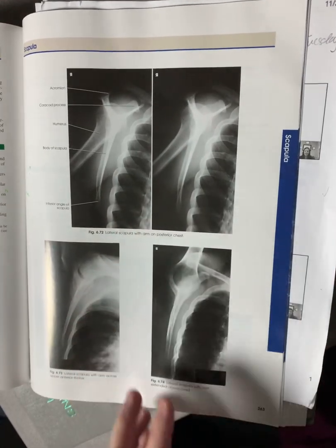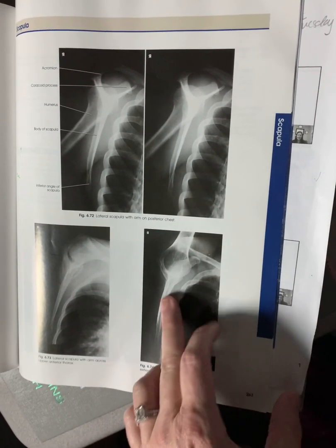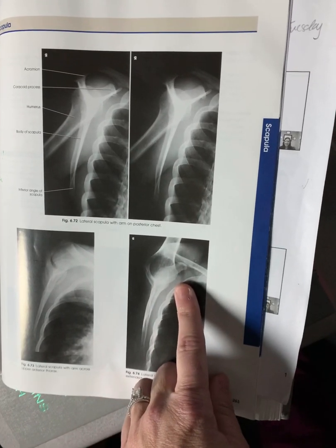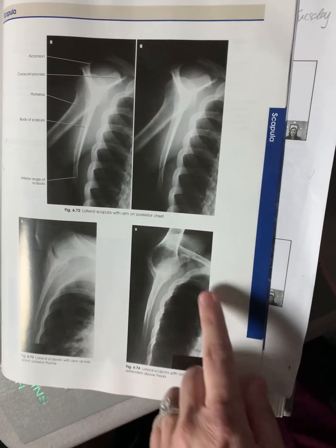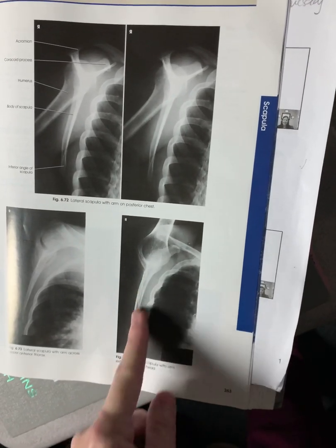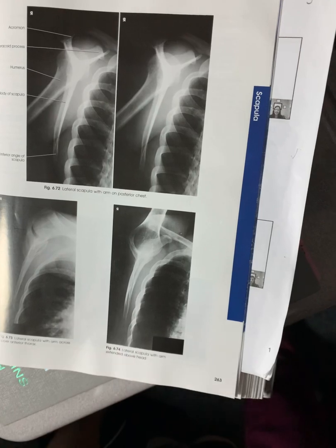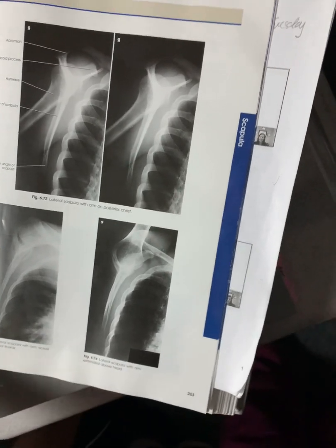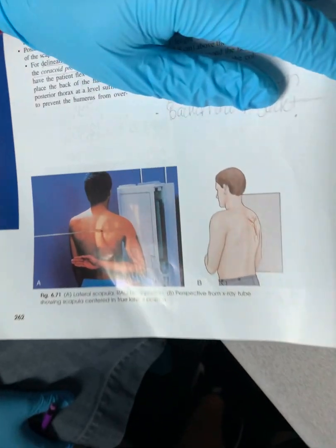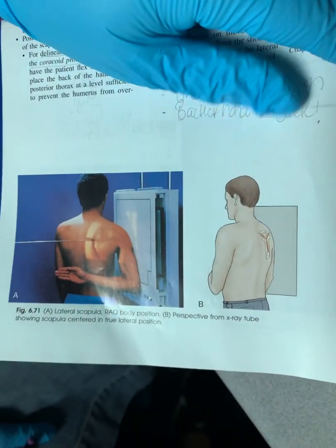Now let's say the patient comes in and the doctor is more interested in the body of the scapula versus the coracoid and the acromion. Then you would bring the humerus and put it on top of the head, okay? And then we're just looking at the body of the scapula. So the picture on page 262, that's how we're doing it for checkoff, and that's how I want to see you guys doing it when you're practicing, okay?